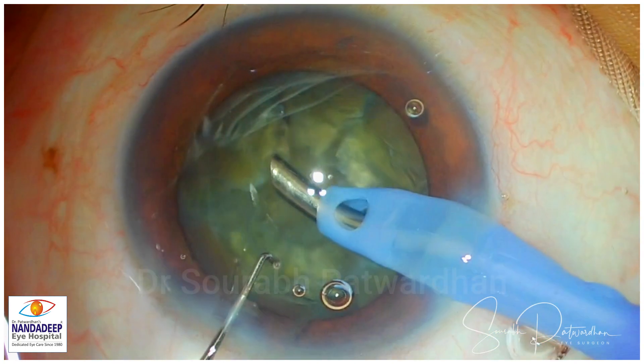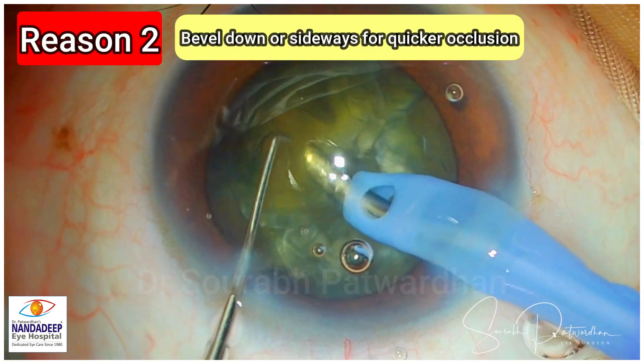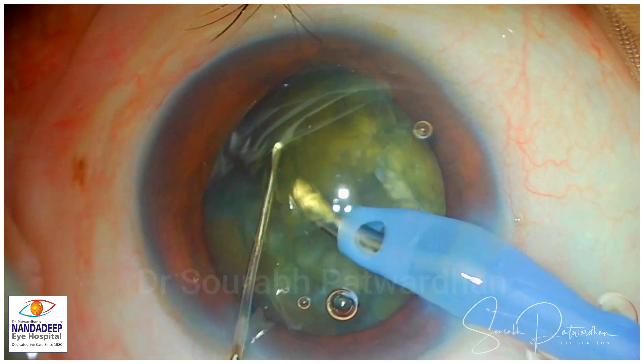Unless the pieces are well separated, they will not come out quickly. Being well down or sideways always helps for quicker occlusion. And we can bring out the piece from the back very quickly with this position of the phaco tip.